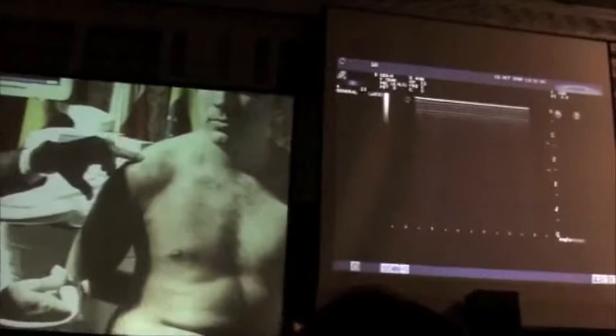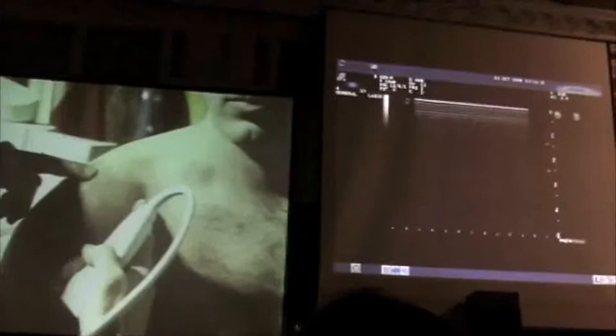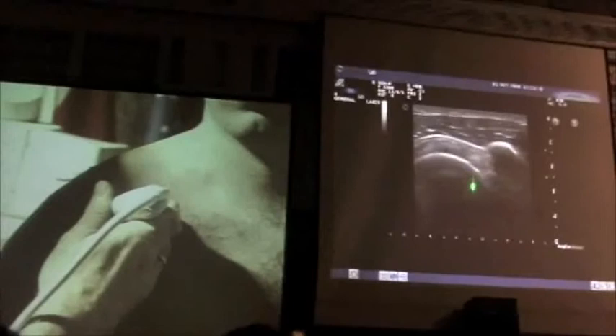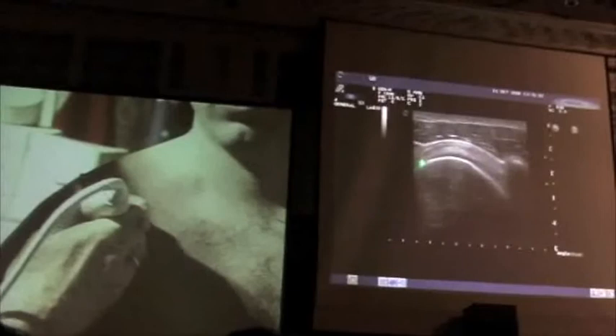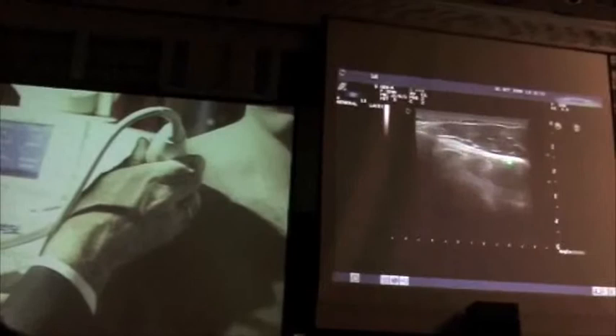I look for the supraspinatus between the acromion process on one side and the coracoid process — that's my window to the supraspinatus tendon. On the right side of the screen is the coracoid process. With that internal rotation you notice only a little bit of the biceps showing in the corner of the image. There is no groove for the biceps because you are in the intracapsular biceps tendon. Counting from this biceps tendon there is about 1.5 to 2 centimeters of supraspinatus tendon.